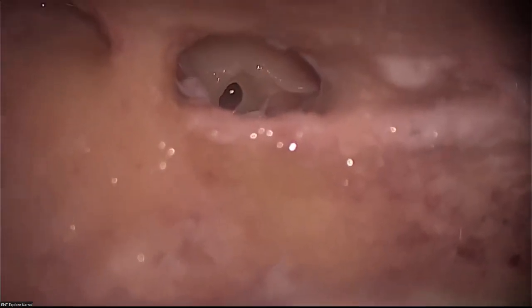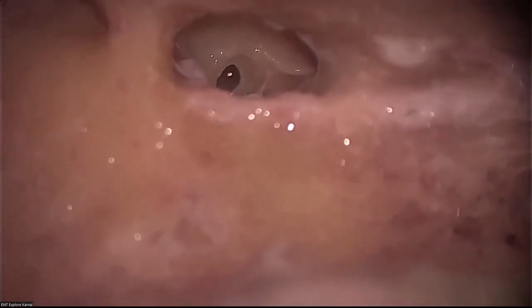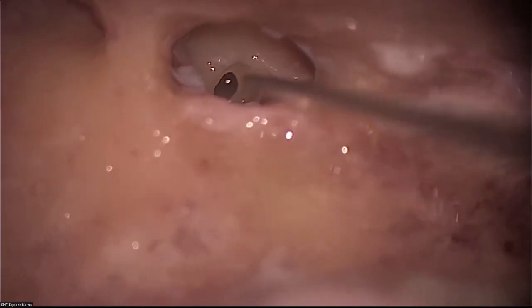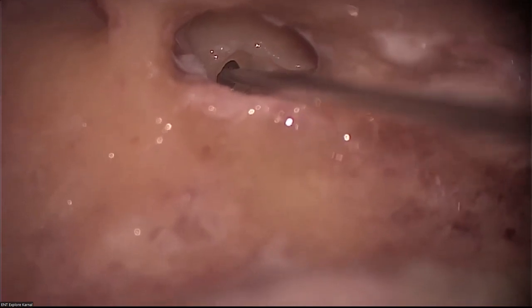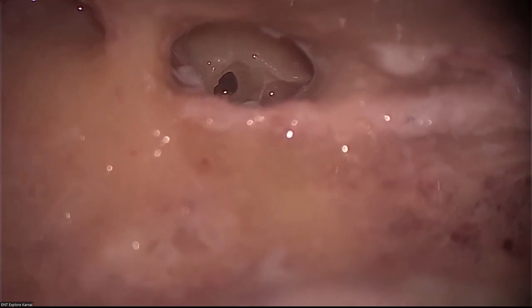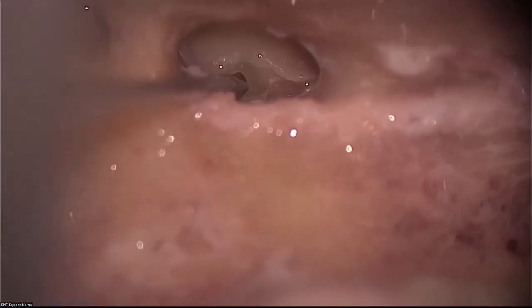Now, one thing: if I push my implant, it will be very tight. We'll uncover the inner anatomy and show you. See, if I push my implant and go straight, see where my instrument is touching, the modiolus. To avoid the implant touching the modiolus and going in the lumen, you need to come from above like this.